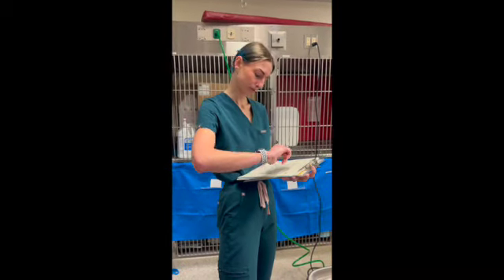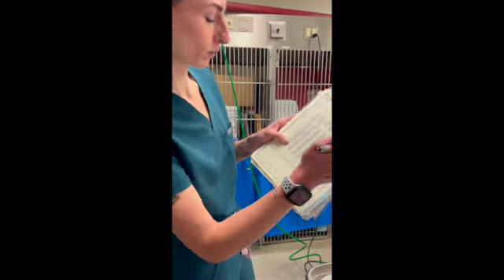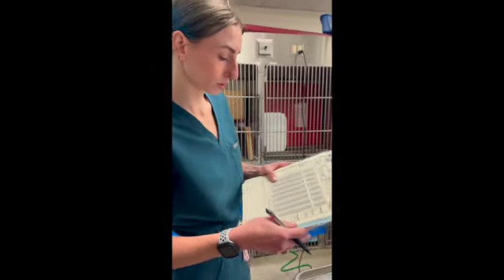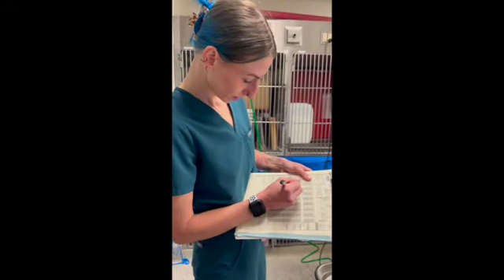It looks like that's a tooth, and then this is another one, so we use different codes for the teeth, and that's how we will put it on our sheet. So I'm just going to go ahead and start with his heart rate, which is 115. For that, we're just going to do a solid dot.